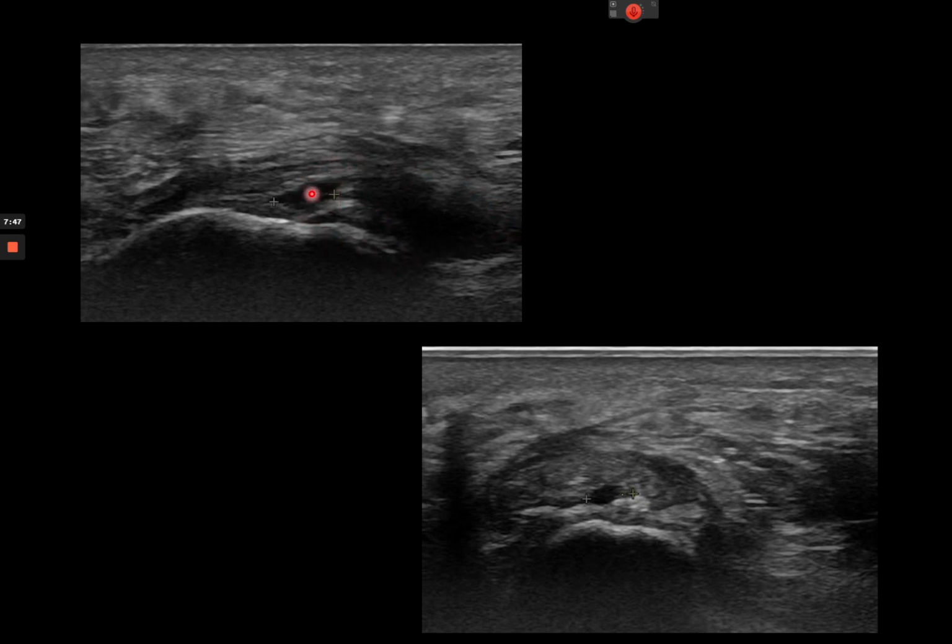area where we get pathology, where that plantar fascia inserts into the deep insertional part of the bone, and this is often where they tear, because mechanically, if you think about where the fascia is going to move around that smooth surface, and if we've got an irregular bone there, it's a bit like a rock climber where they've got rope that's hanging off a sharp piece of rock. It's not usually a good idea. It'll last for a while, but then over time you can get an increase in wear and tear on the rope. Same thing happens with the fascia.